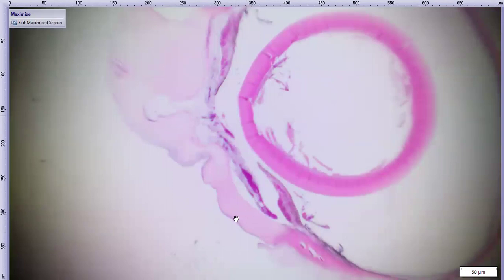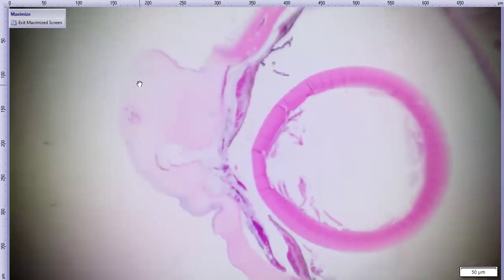Here is more normal corneal stroma, so it should be this hue, it should be about this thick. And when we go axially or centrally, it's very pale and very expanded. So that's that corneal edema I mentioned. Also, we have this sort of deep corneal stromal cavitation. And then there's some hemorrhage in the anterior chamber, and there's also hemorrhage in the iris stroma.